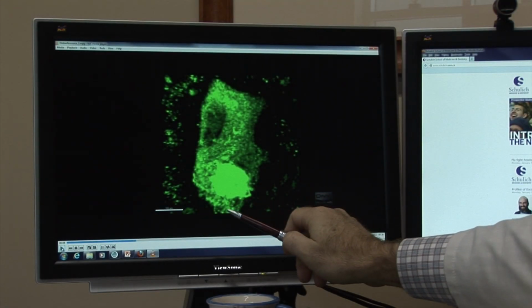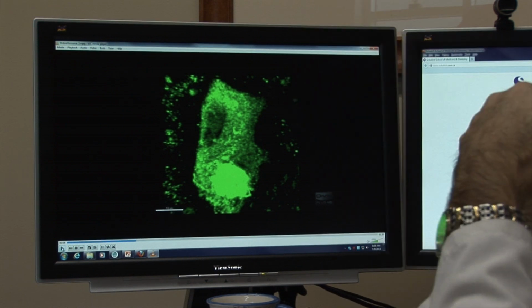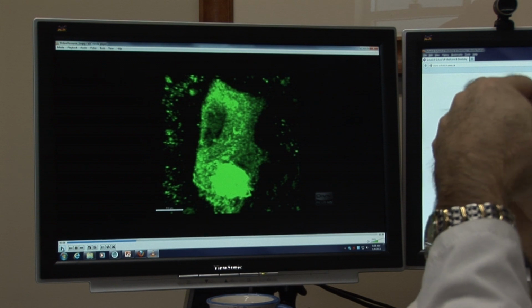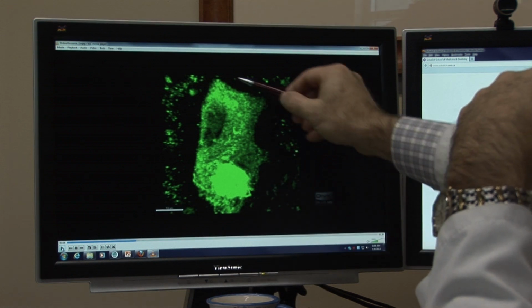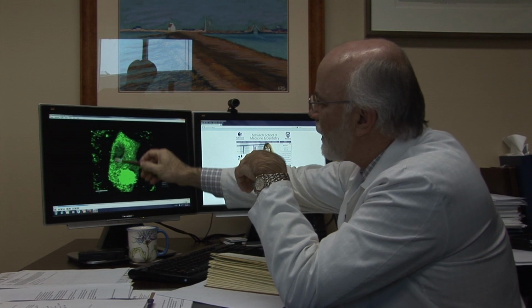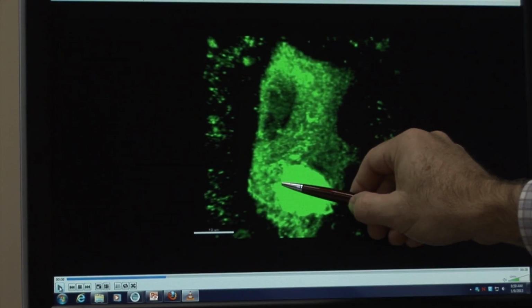So what you're looking at here is a motor neuron. This is in the individual who dies from ALS. The problem is that in the spinal cord, the individual motor neurons are dying. And when we look at it through the pathology, what we see is a very large cell, which is what we expect to see. This is where the nucleus of the cell sits. And then this area here, this sort of rock-like material, very dense aggregate, should not be there.